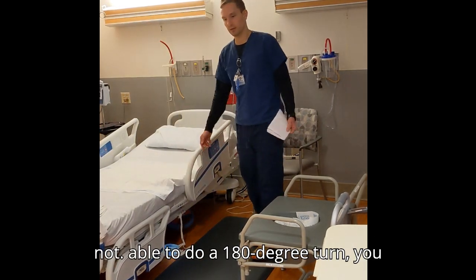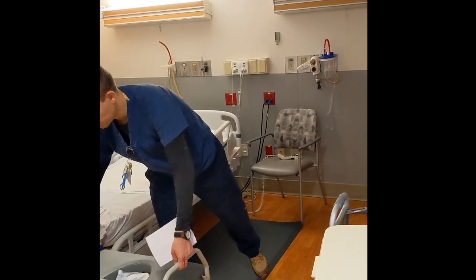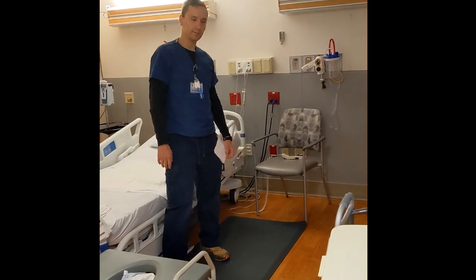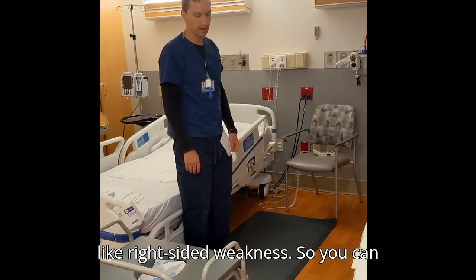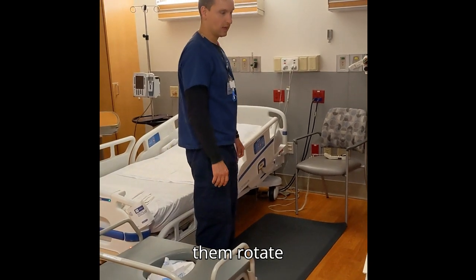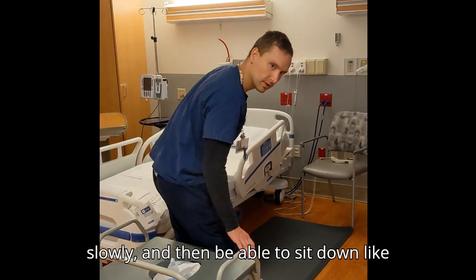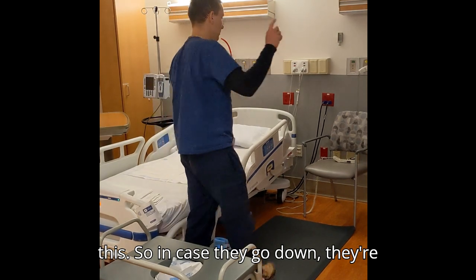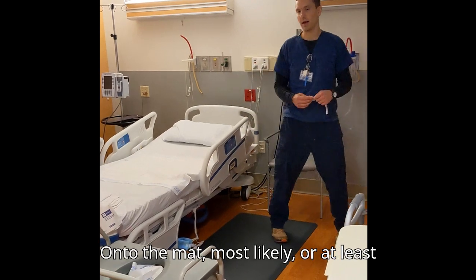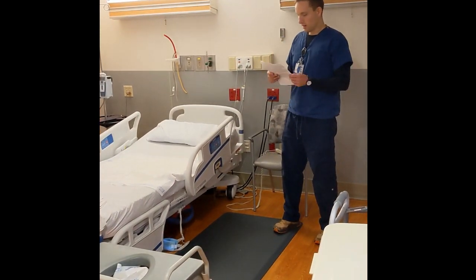If they're not able to do a 180-degree turn, you could put the bedside commode here. Let's say they have right-sided weakness, so you can get them out of bed and then have them rotate slowly and then be able to sit down like this. So in case they go down, they're going straight down onto the mat most likely, or at least relatively straight, instead of onto the floor.